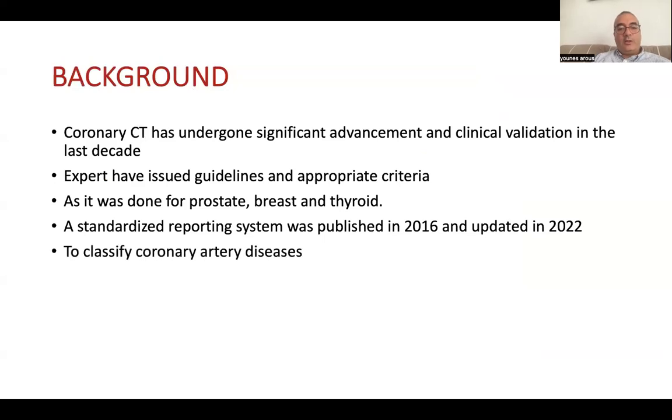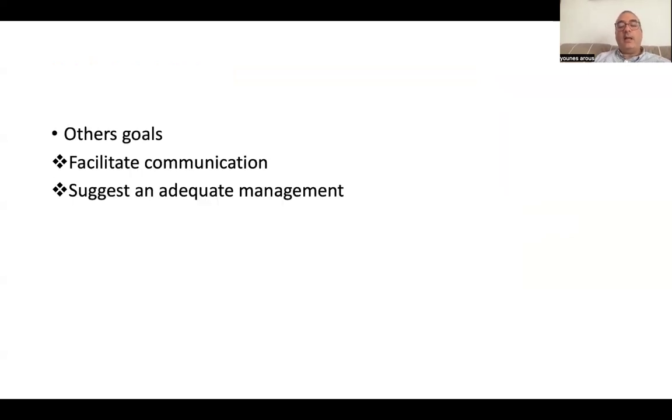The main objective was to classify coronary artery diseases. Between the two classifications, there were two major modifications: the introduction of plaque burden grading and ischemia. The other goals of this classification are to facilitate communication between radiologists and cardiologists and to suggest adequate management.